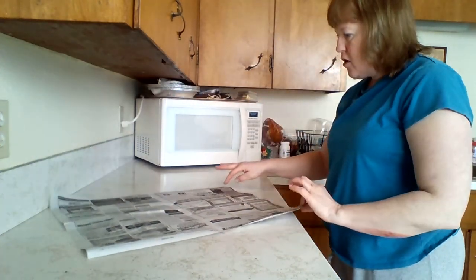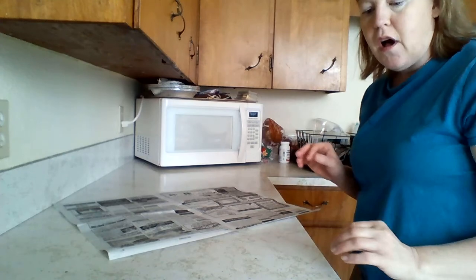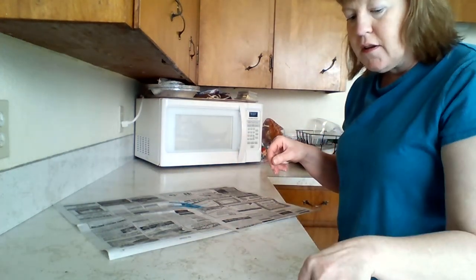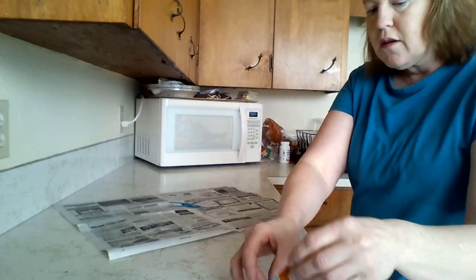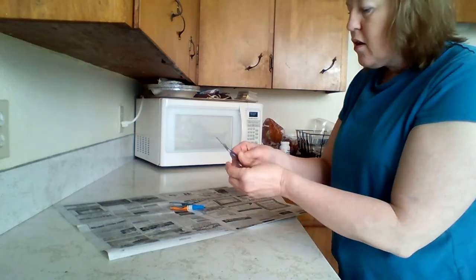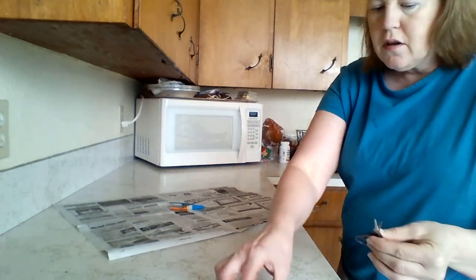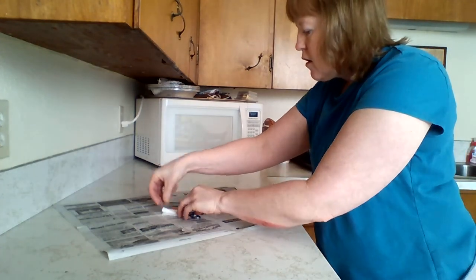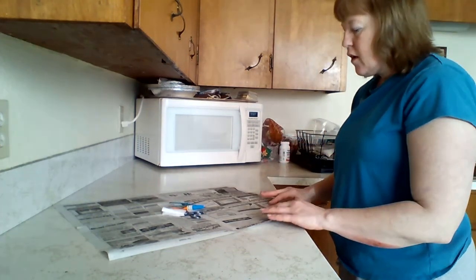Here's my paper, my muslin cloth. I'm going to lay the instruments slightly open, cover the tips. Okay.